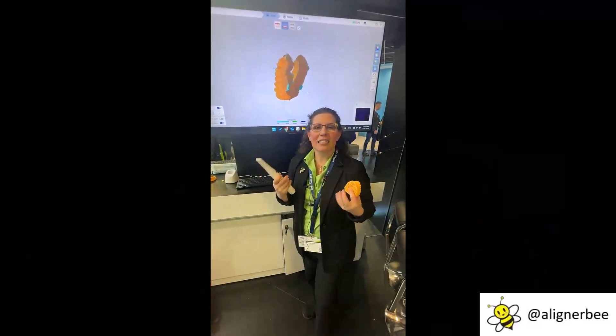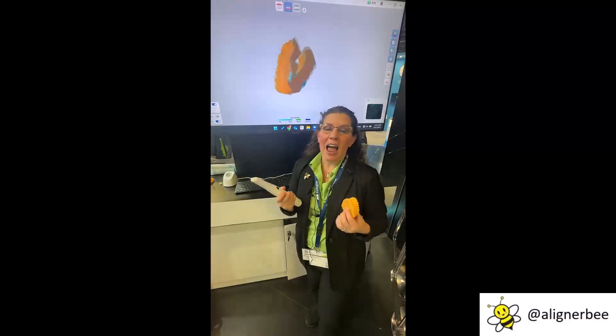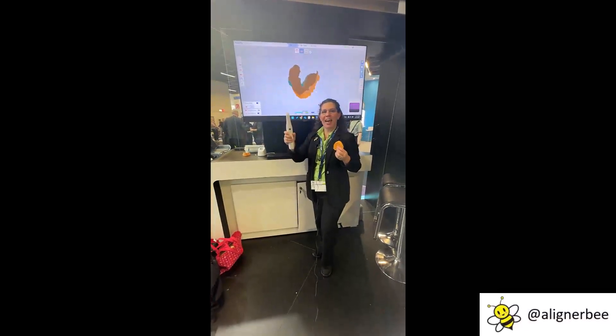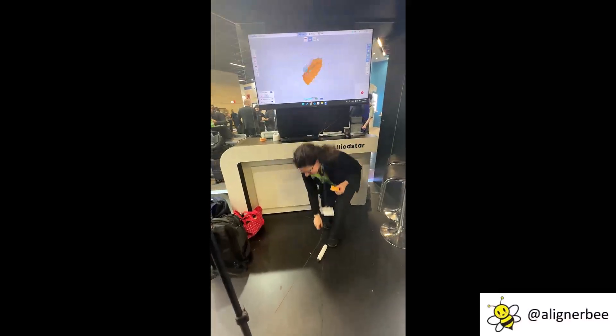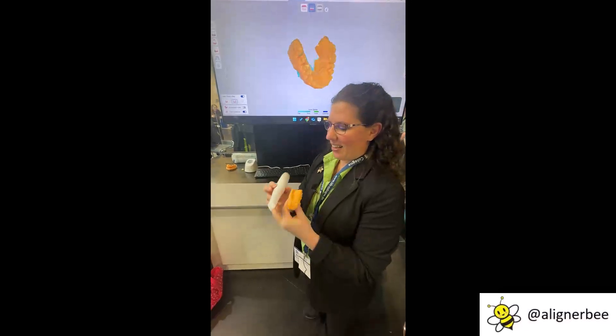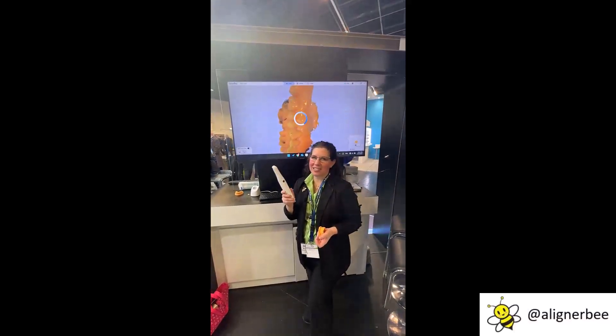One of the things I'm always interested in is how things are built rough and tough for the dental space. For many of us, our biggest concern is a scanner getting dropped — however, Allied Star has worked around that. And as we can see, even with a drop, the scanner is ready to keep going and scan again.